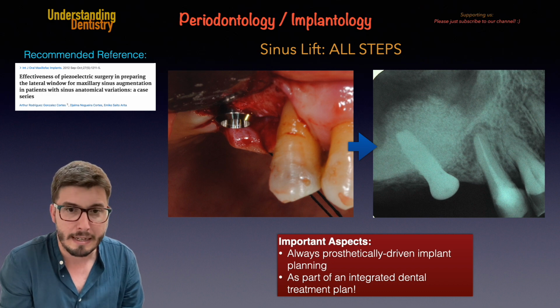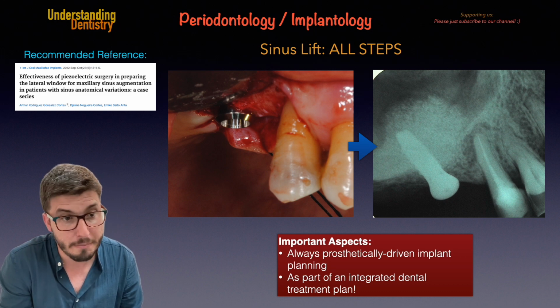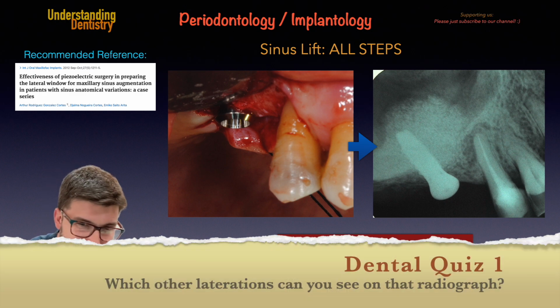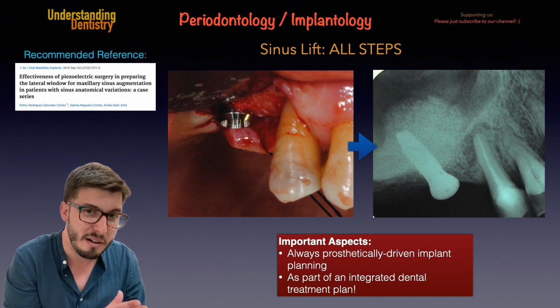Okay. Of course, this periapical radiograph is oblique, the way it was taken, but the implant allows for the rehabilitation of the site, right? And we can see that, take a look at the area of the periapical lesion of the second premolar. Now it's healing. We can see in the periapical radiograph that the radiolucency of this area is also similar to the radiolucency of those mesial areas, right?